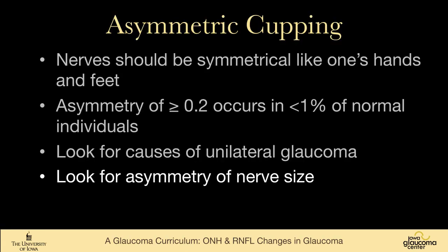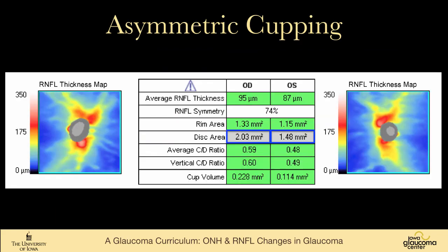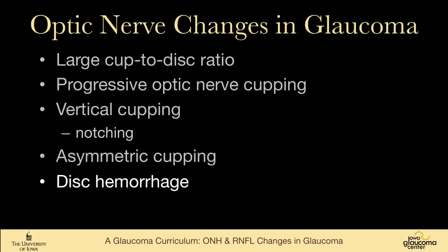When you see asymmetry of the cup, you should look for asymmetry in the nerve size, because that can occur. This patient clearly has cup to disc asymmetry with a larger cup in the right nerve, but the right nerve is also larger than the left nerve. You can see the area of the right nerve is quite a bit larger than the nerve on the left, and actually the eye with more cupping has a thicker average retinal nerve fiber layer than the other eye.